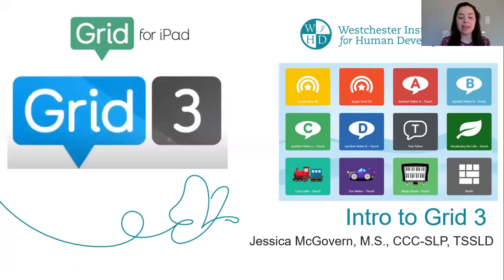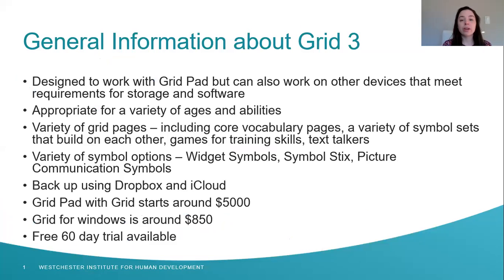This month we're having AAC Awareness Month. We're running a series of webinars about different AAC devices, and today I'll be talking about Grid 3. Grid 3 is designed to work with the grid pad, but can also work with other devices that meet requirements for storage and software. It's appropriate for a variety of ages and abilities.